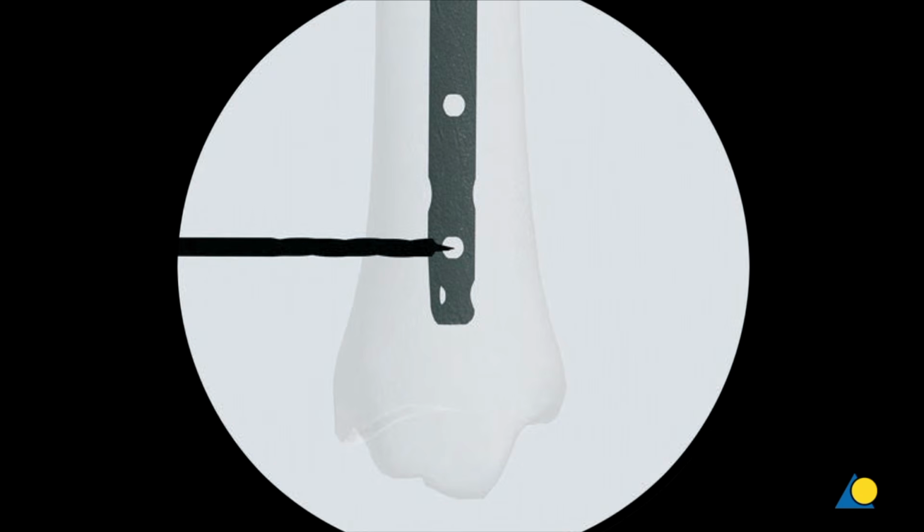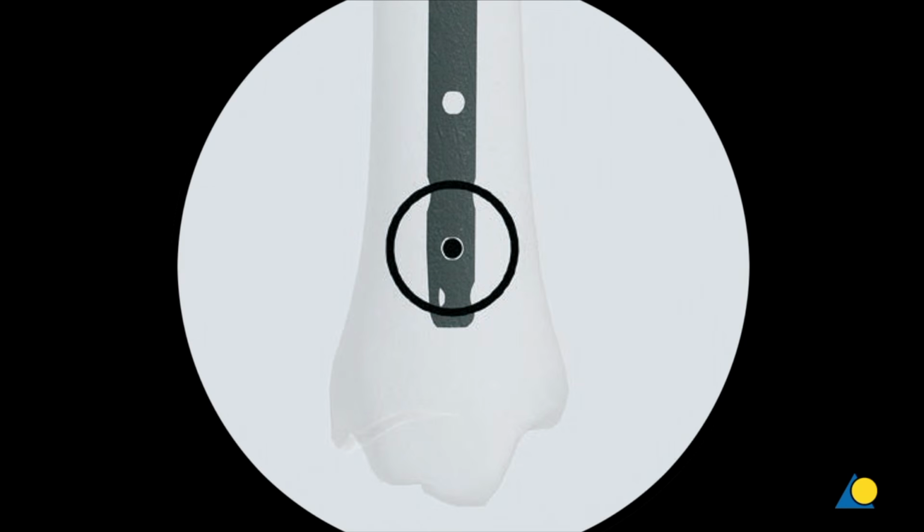Using the radiolucent drive under image intensification, the tip of the 3.2 mm drill bit is inserted through the incision down to the bone. The drive is angled so that the tip of the drill bit is centered over the locking hole. The drill bit should nearly fill the circle of the locking hole. The drill bit is held in this position while the hole is drilled through both cortices. Drilling is stopped immediately after both cortices have been penetrated.